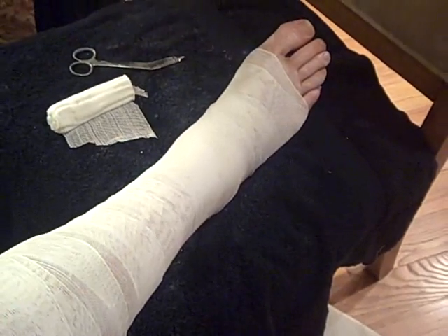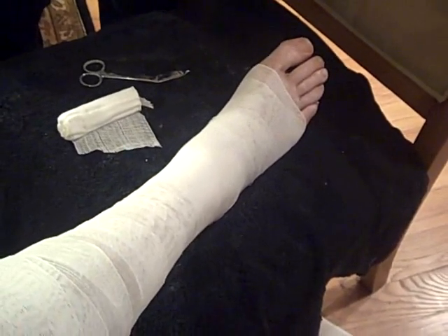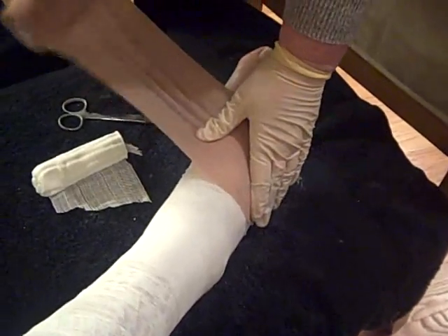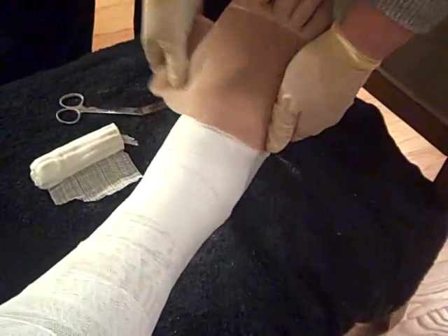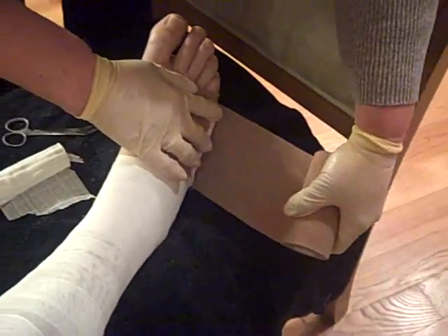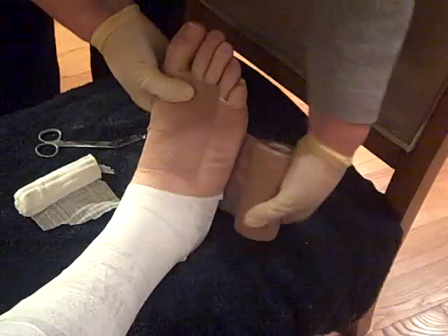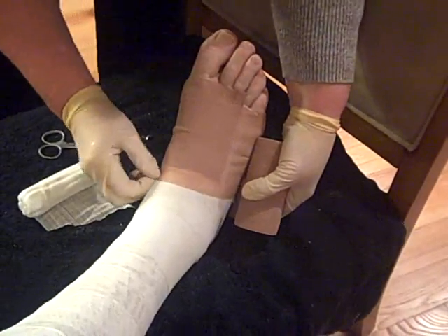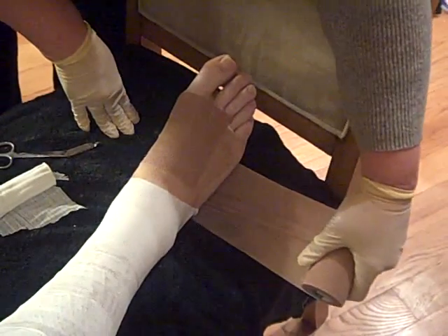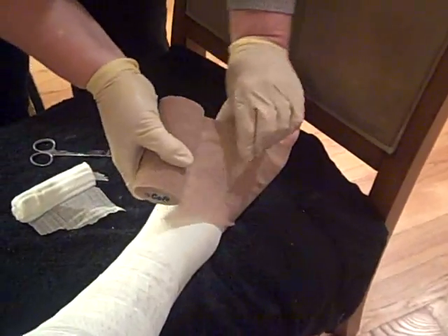With this particular ointment, we're going to be putting on a co-band, but we're only going to be putting that on to a half-stretch. So we're going to come back over the area where we've applied the ointment and bring the co-band to about 50%. There's 100%, then you come back halfway and continue. When you do the stretch, you want to come out to 100% just to get an idea of where you're at, and then bring it back halfway, which gives you that 50%.